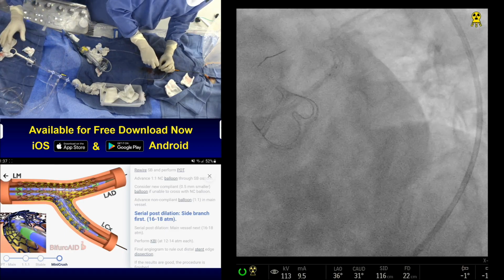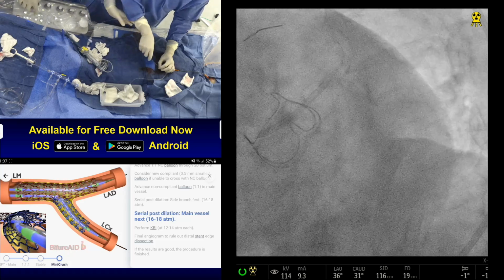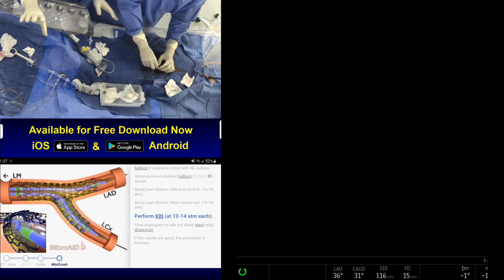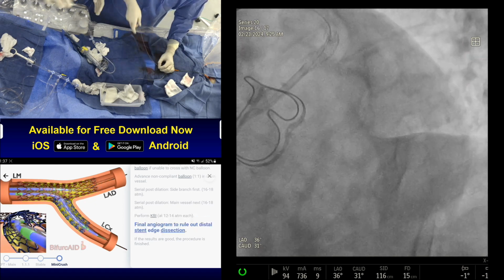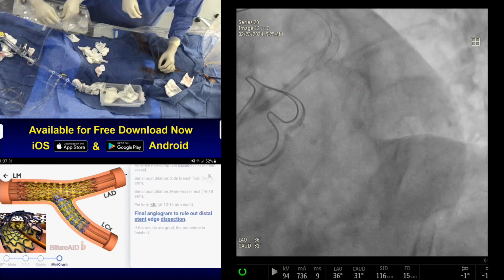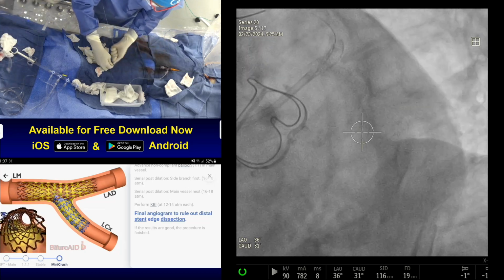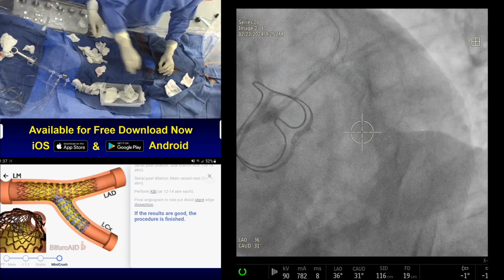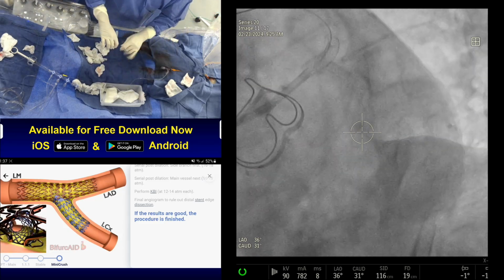We don't have a picture. No, but that's okay. We don't need the picture. Yeah, good. Now, 1 second. Just make a dry cine. Look at the Megatron, the cells. See that? The cells of the bigger proximal versus distal. So exactly what was shown in that cartoon of the stent. So that's a difference. It gives you extra strength. So it comes, as I mentioned, 4.0, 4.5, and 5.0, and that may require it.